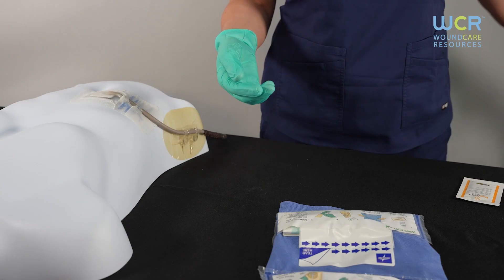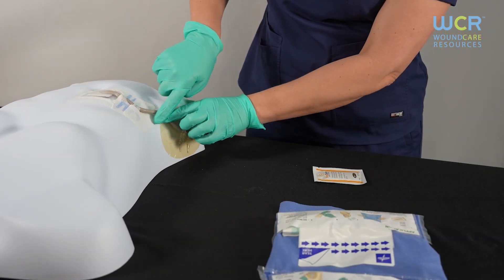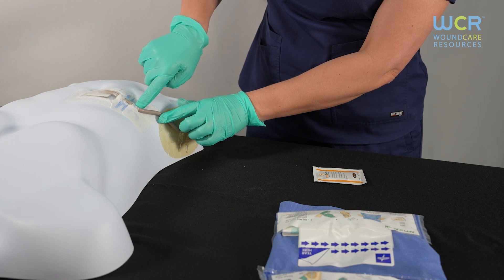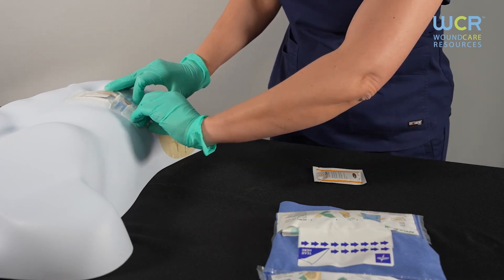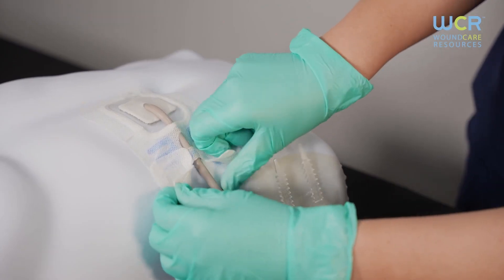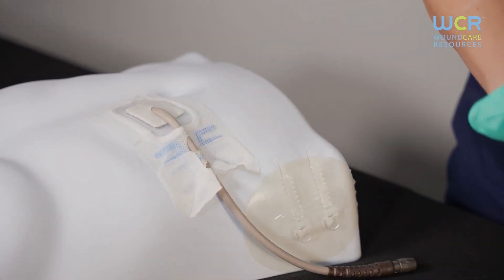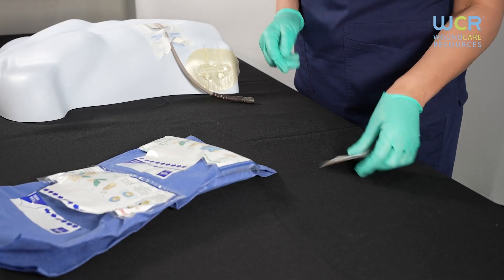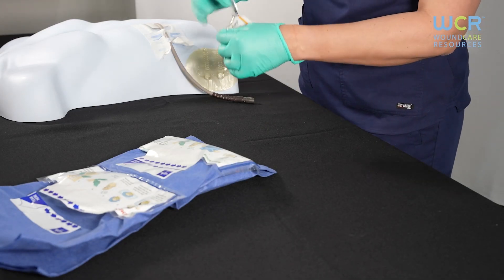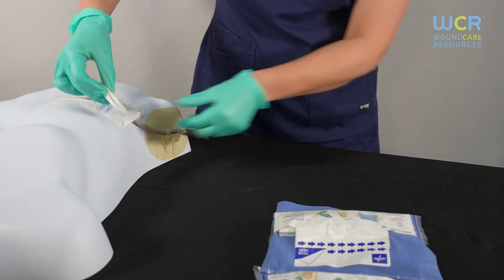To remove the dressing, locate the V-notch underneath the driveline. There is a perforated section from the V to the driveline for easy removal. Once you've located the V-notch, lift and pull apart at the same time on each side to tear the perforated section. Then take the Freederm Adhesive Remover Wipe and wipe underneath the dressing or anchor as you gently pull down with your other hand.